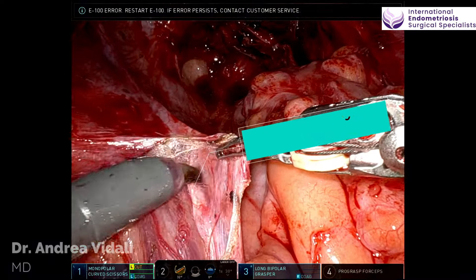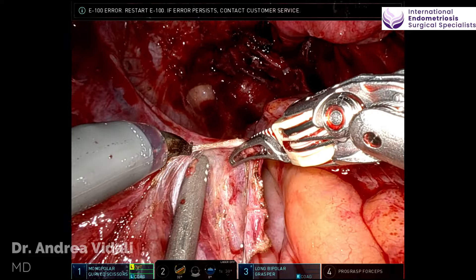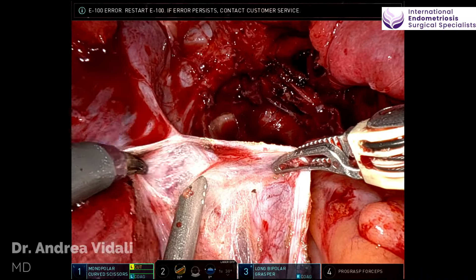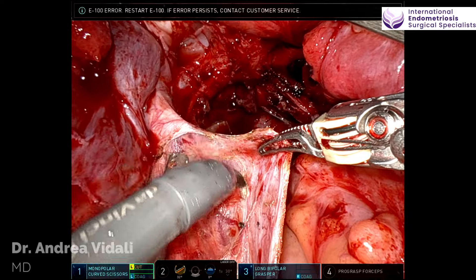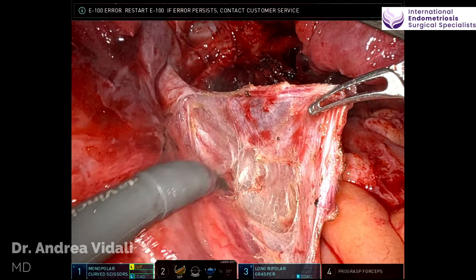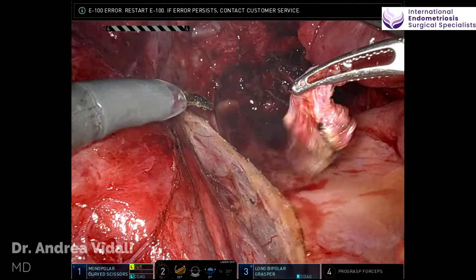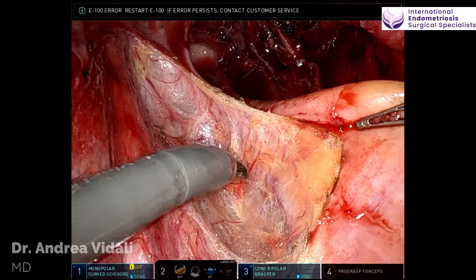Every endometriotic procedure starts with the identification of the ureter on each side and dissection of the ureter. This helps speed up the operation because once your ureters are lateralized, you don't have to worry too much about hitting them when you're working more centrally. This is, of course, going to be a nerve-sparing surgery. As I am dissecting the peritoneum and entering the retroperitoneal space, you can see that I can already identify some retroperitoneal structures.